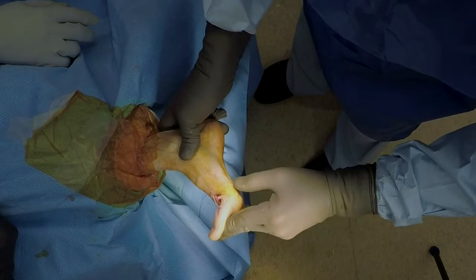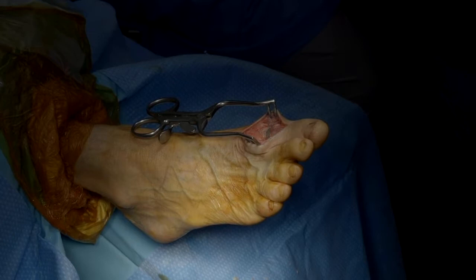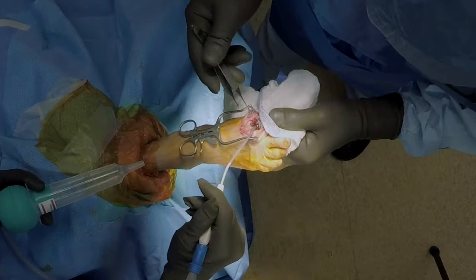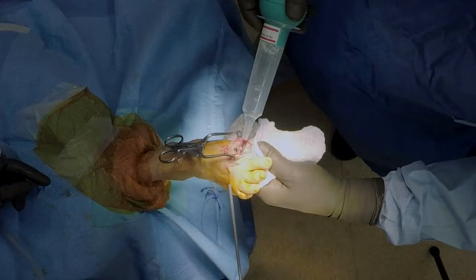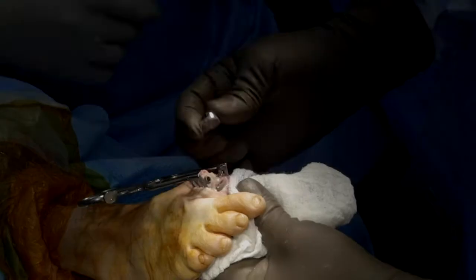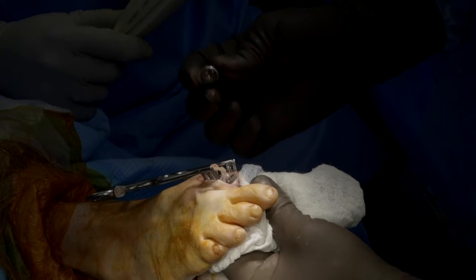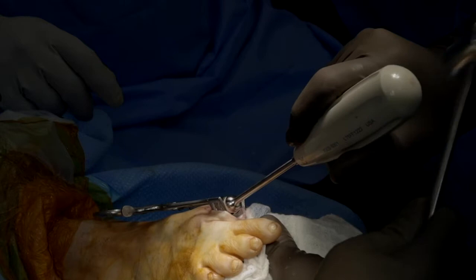After you have finished everything and are getting ready to put in your implants, I actually distract the toe, look underneath at the sesamoids, and pull down really hard, then take my irrigation. The last thing you want is to leave any debris or particles on the plantar surface, so wash this out really well — make sure there's no debris anywhere. Here's my final component. I take this tapered post, put it in the post, and the taper on the implant seats. To seat the two of them — just like a total hip — Lori's going to hit it a few times. Gently hit it because it's a Morse taper; it will lock itself into position. You can grab it, see if it's going to pop off, and it doesn't.